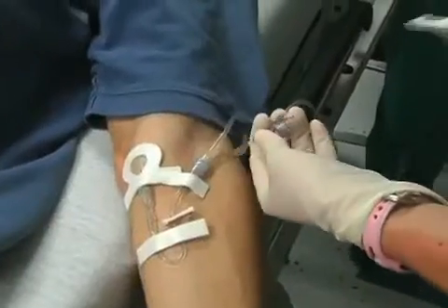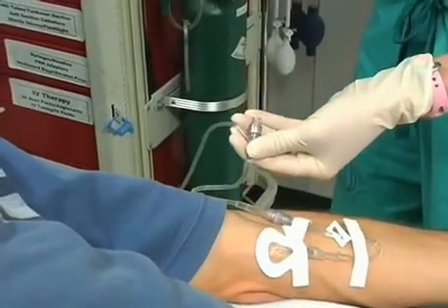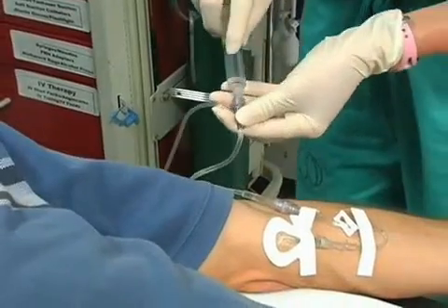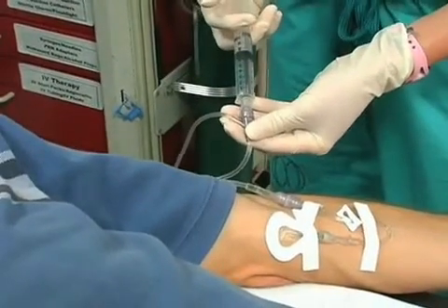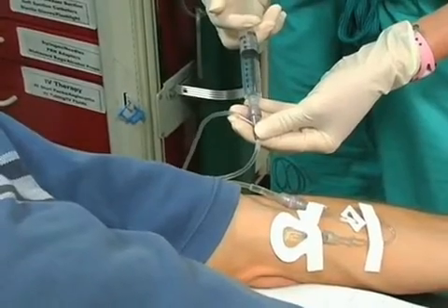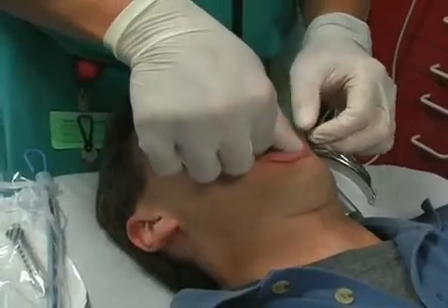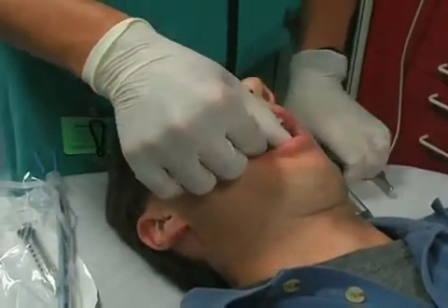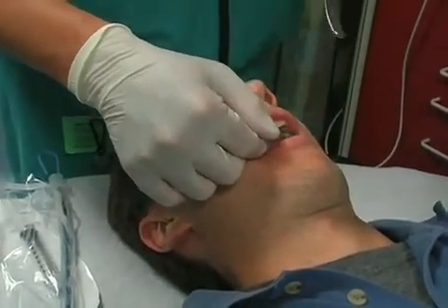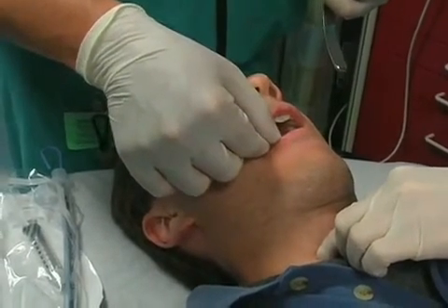Here we see administration of the induction agent, followed by the neuromuscular blocking agent. Pre-treatment begins approximately 2 minutes into the pre-oxygenation period and 3 minutes before intubation. These drugs are circulated until the patient's musculature is noted to be loose and spontaneous breathing has stopped. At this point, cricoid pressure is applied to prevent aspiration.